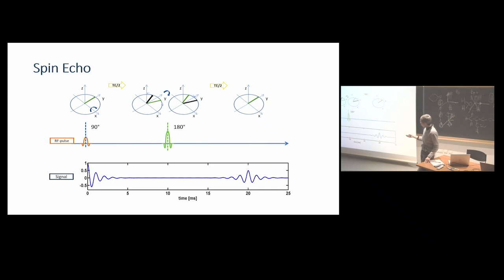Here, you see that the signal disappears. This is due to dephasing. So you can imagine Erwin Hahn, when he did this experiment in the 50s, he put this 180-degree pulse in here, and suddenly the signal came back. So clearly these magnetic properties are really interesting because there are both reversible and irreversible processes that you can study. And the 180-degree pulse brings back all the reversible effects.